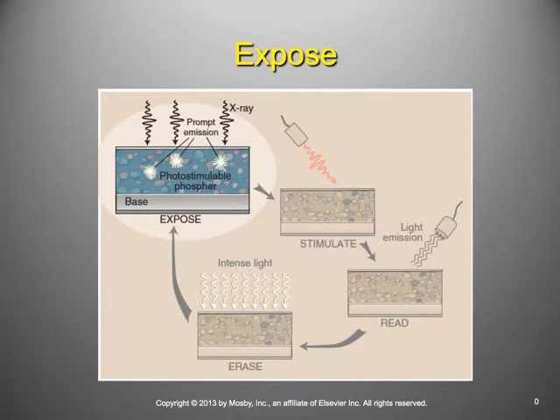Light is emitted when an optically stimulated luminescent crystal is stimulated. The same thing happens with a PSP. So when an X-ray beam exposes, and here we see the X-ray beam exposing the PSP in this image right here, the energy transfer results in an excitation of the electrons that are there. Okay? And so they wind up in what we call this metastable state, where they're not really bothering anyone, no one's bothering them, the atoms are just kind of resting.